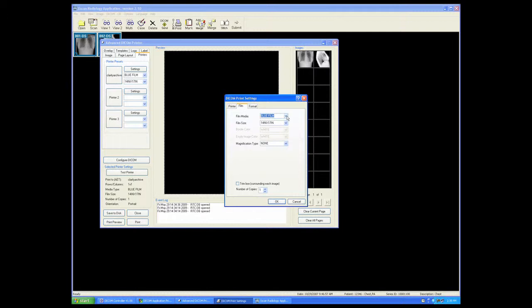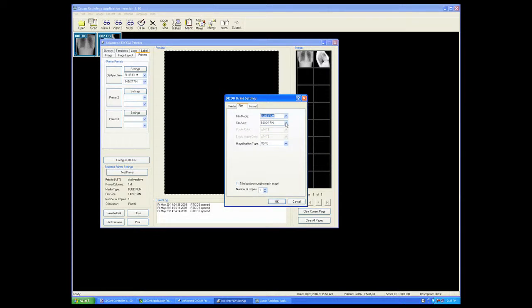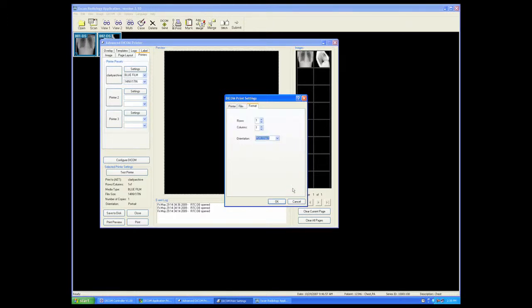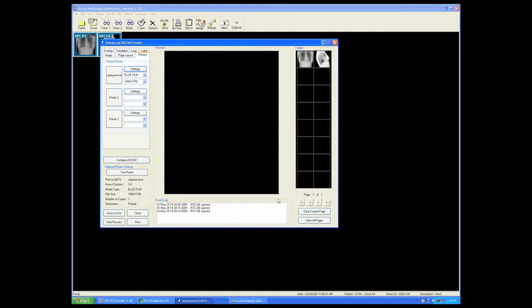Select the size of film that is being used from the film tab. Select also the proper size and format. Once that is done, you can test the printer with the test button.